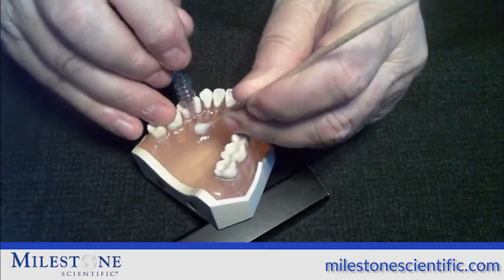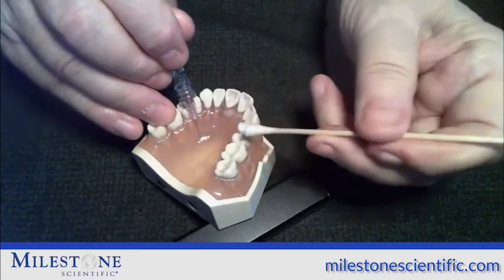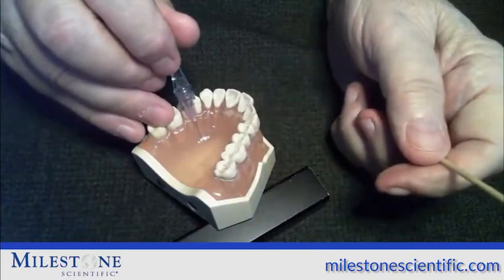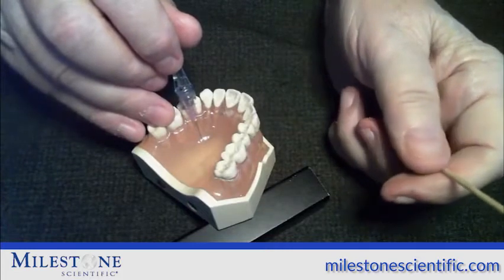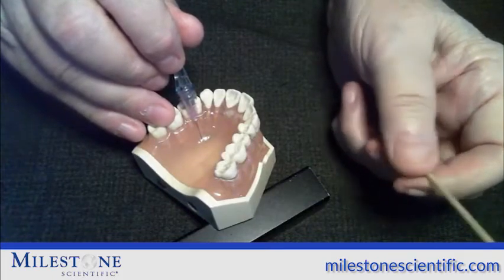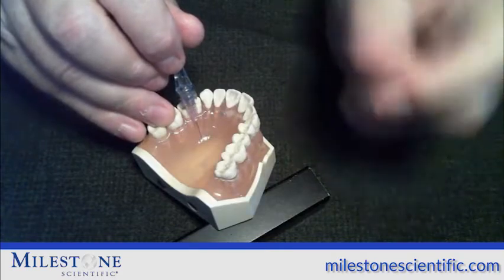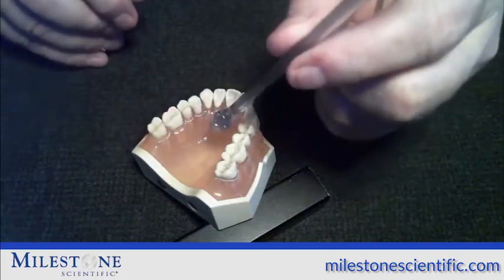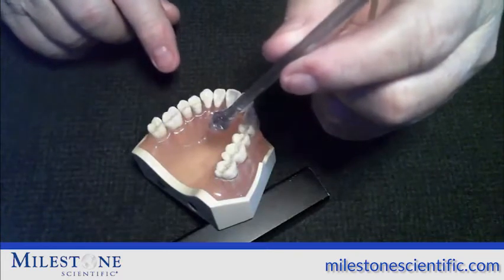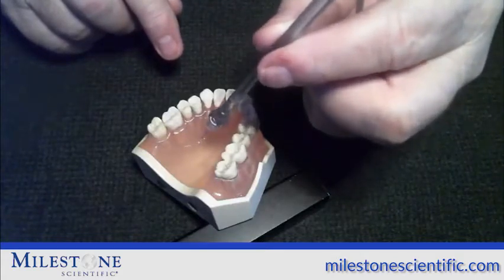Now we're on cruise control throughout the whole injection. After about 10 seconds of pressure on the back end of the needle and the tissue, we take away the cotton tip applicator and with a finger rest, all we do to penetrate the tissue is rotate the needle one, two, three. It just barely pierces the tissue — possibly half a millimeter to a millimeter — and the patient doesn't feel that. Before we start to penetrate through the palatal tissue, we should let some anesthetic go into the tissue, so we pause for five or six seconds. During that pause, rotate the needle so that it's going directly to the bone and the flow rate will be towards the premolars. After about five or six seconds, slowly, slowly, slowly start to move the needle through the palatal tissue to the bone.